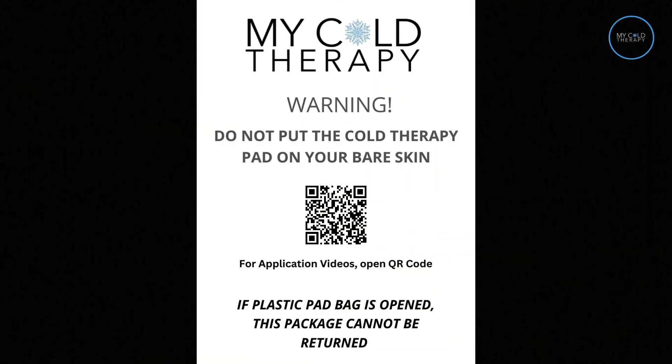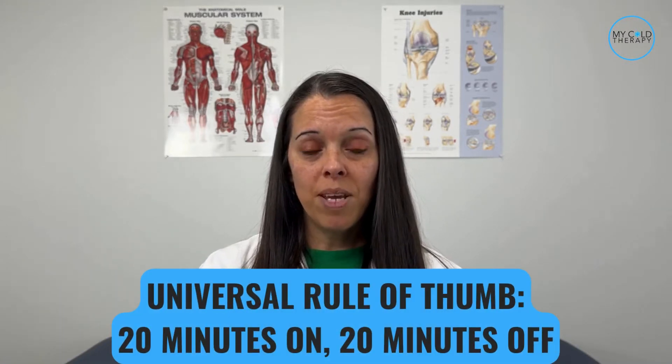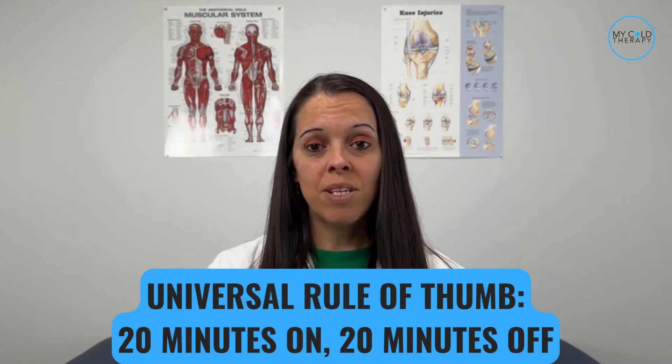The other item you're going to get is a skin warning flyer. You never want to put the cold pad directly on your skin as it could cause some damage or frostbite. The universal protocol for cold therapy is 20 minutes on, 20 minutes off.